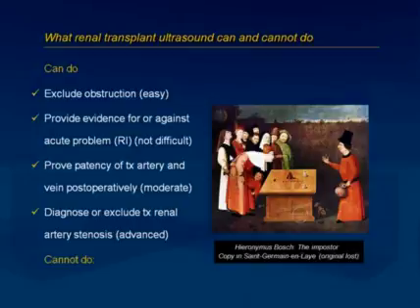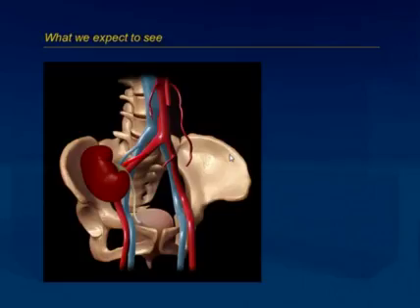What it cannot do is equally important. Transplant ultrasound can't diagnose or exclude rejection. The best we can do is provide evidence of an acute problem by measuring an increased renal resistive index, but to diagnose or exclude rejection is actually still the role of the transplant biopsy.